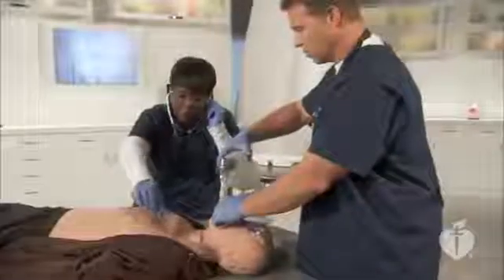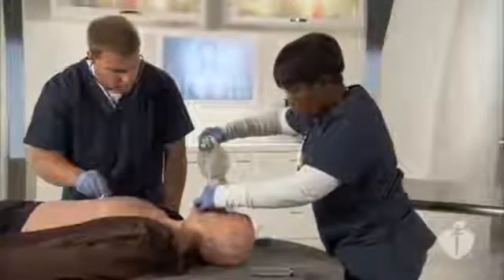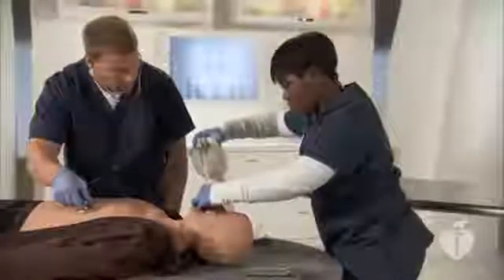When choosing to use an advanced airway, you need to be confident that it is inserted correctly and that you are providing effective ventilation while avoiding excessive ventilation. Watching for chest rise, checking for bilateral breath sounds, and listening for gurgling sounds coming from the stomach can help you confirm the placement of an advanced airway. Beyond these clinical assessments, there are several devices that can help you determine whether you have inserted the airway correctly.